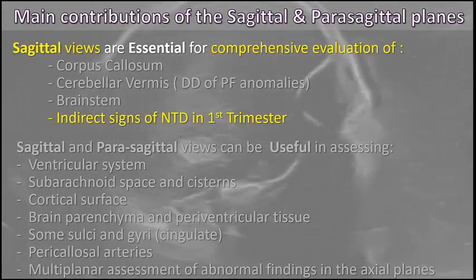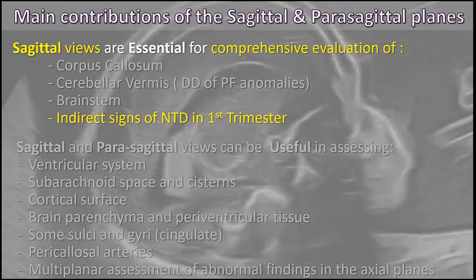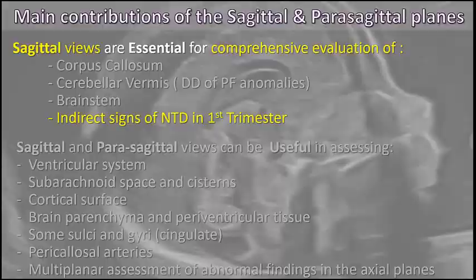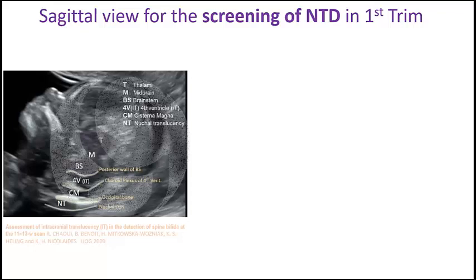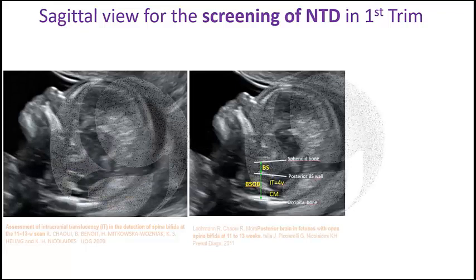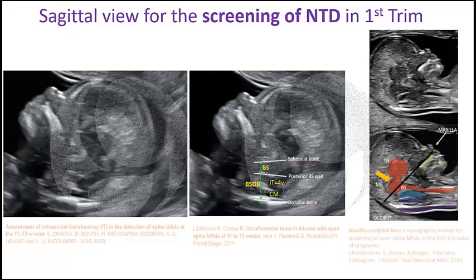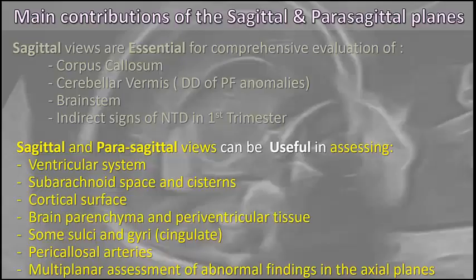In addition to the assessment of the corpus callosum, cerebellar vermis, and brainstem, the sagittal planes are also essential to detect indirect signs of neural tube defects in the first trimester — such as the intracranial translucency as described by Professor Chaoui, or the ratio between the brainstem and the brainstem-to-occipital bone distance, or the maxillooccipital line. So the sagittal views are also essential in the first trimester.